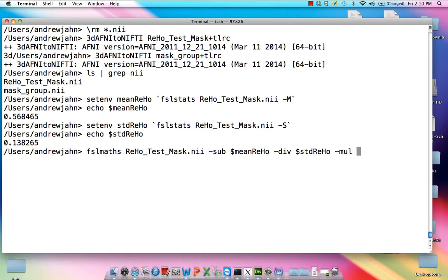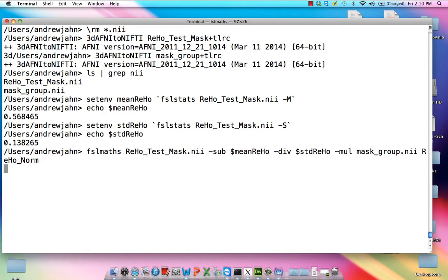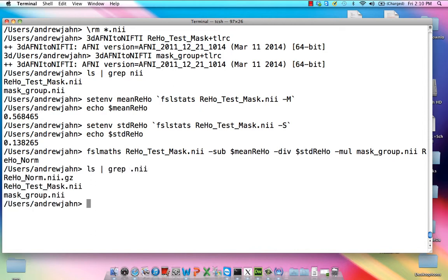And we're going to multiply this by our mask, which is maskgroup.NII. And let's call this output RehoNorm. Okay, once we've done that, simply just check to make sure that it does, in fact, exist. It should have a .nii.gz as the extension.